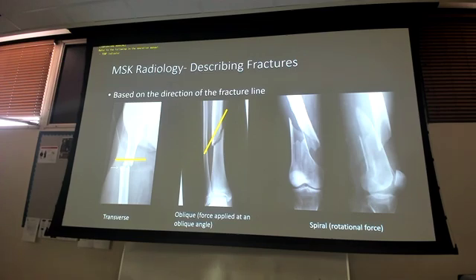Are the images stored so you don't have to go get another X-ray, or maybe they present it a certain way, but then we found an abnormality? Like, hey, you took pictures last week. Can I go back into them? Are they digitally stored so I can go back and find more details? So what you have here for X-ray is what you have, right? You can go back and look at it again, yes, but you can't move it into a different position or look at it from a different angle. Like CT has layers. Correct. From an X-ray standpoint, you can't because it's just a solid 2D picture and that's it.